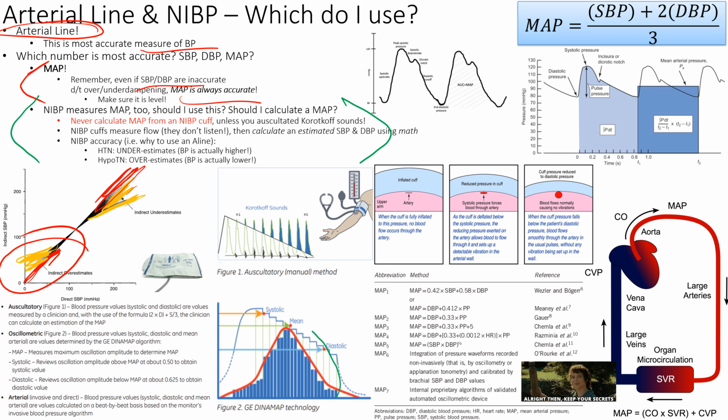And they won't tell you how it works. They keep their secrets. We have no idea how they calculate a MAP. It's like they use some kind of proprietary formula, like the 11 herbs and spices. GE has their own private formula to ascertain a MAP. They say, hey, this is your MAP, and we just have to trust it, right? Because they say, oh, we validated it, we promise. Pinky promise? Yeah, pinky promise. You validated it on 1,000 people. So okay. For me, I kind of want to know how they got the MAP.